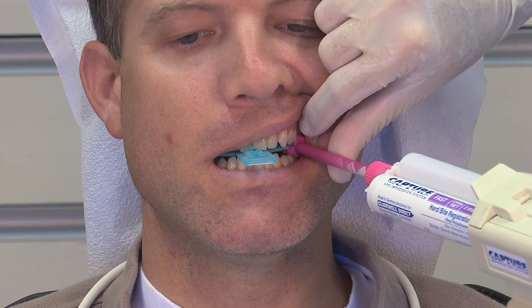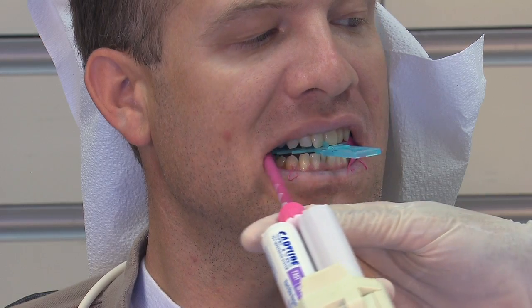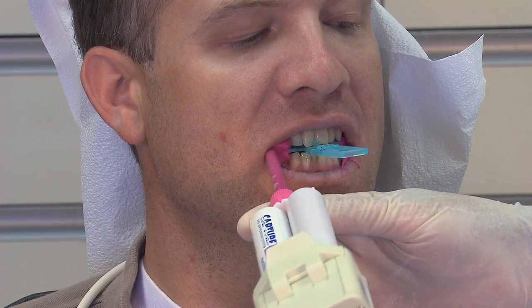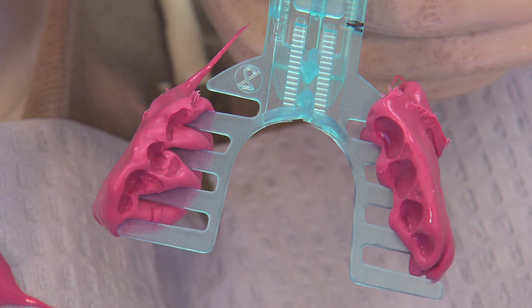we're going to squirt bite registration onto the forks and in between the posterior teeth and have the patient turn. And again, just expressing some polyvinyl bite registration onto the forks of the protrusion gauge and around the teeth. The little bit will go onto the occlusal surface as well, and 60 seconds later, you can see that we've got a nice protrusive bite here at the halfway point.